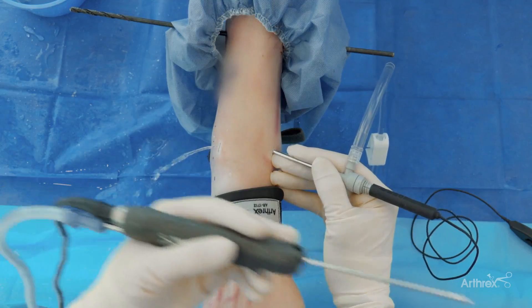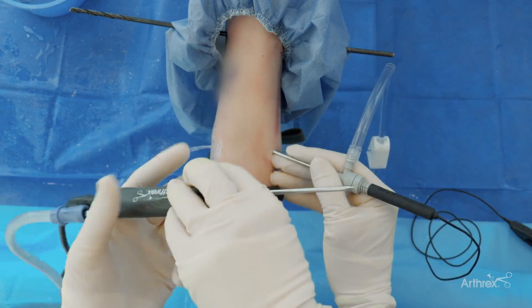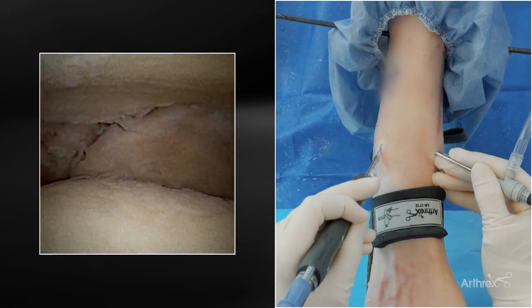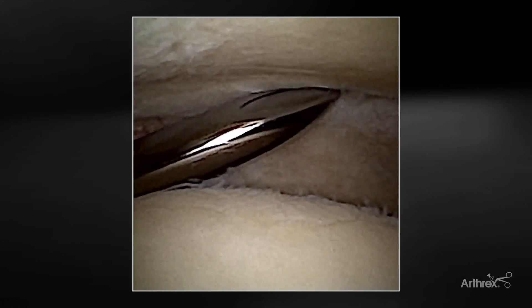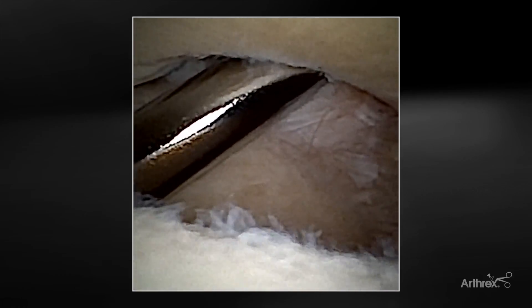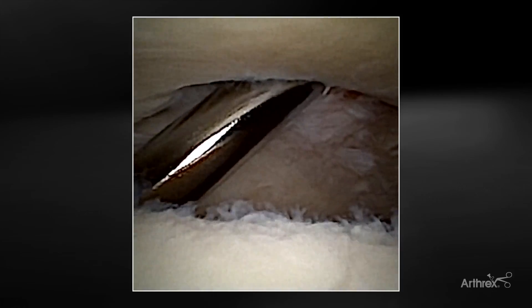If you come over to the fibula, when I'm doing diagnostic things I like the size of a 3-5 because several studies match up to that diameter for confirmation — I'd like to know if there's any instability of the syndesmosis. If you come over to the front, the anterior face of the fibula, and you give it a little subtle push, you'll see some widening. I would normally push right here and you'll see the fibula rock back and sometimes rotate slightly. If this was intact — and I did release it in preparation for this to demonstrate — if you can get a 3-5 shaver in between, studies show sometimes 2.5 or 3-0. Guyton's paper uses a 3.0 millimeter probe: if that fits into the syndesmosis, that is considered unacceptable instability and you should not just do your Brostrom.